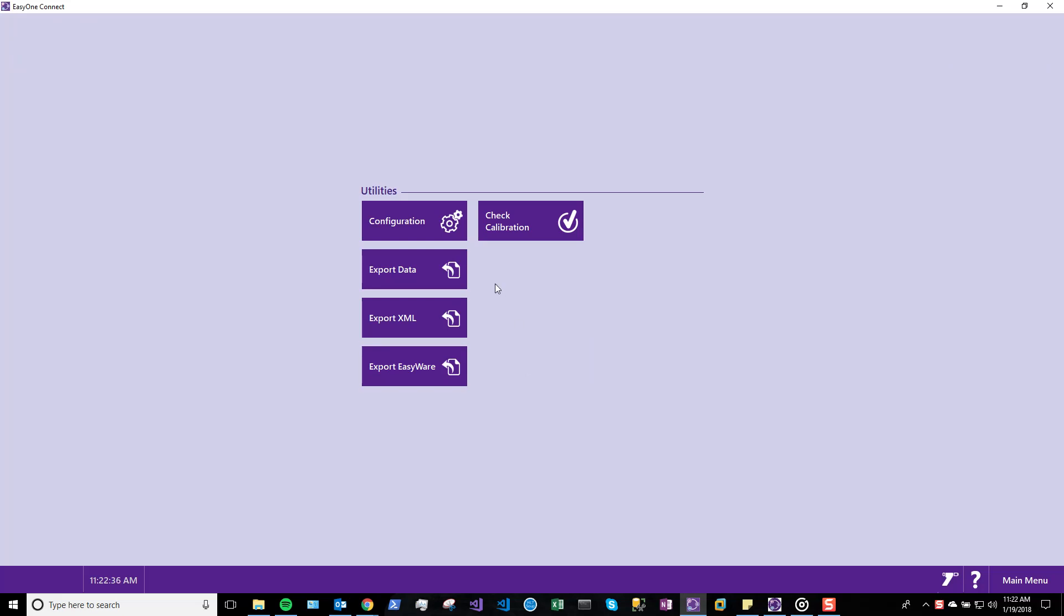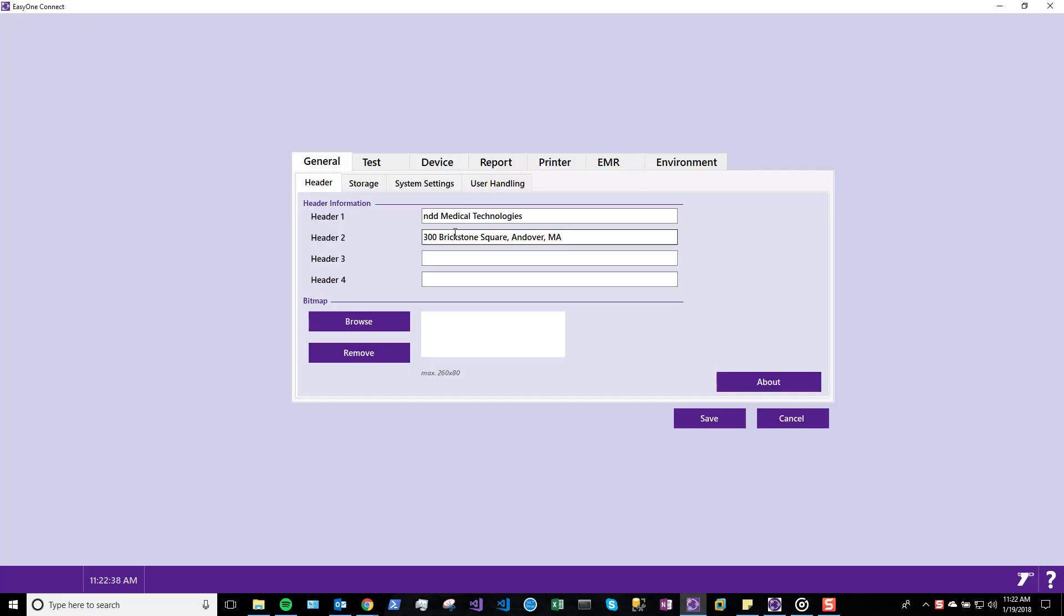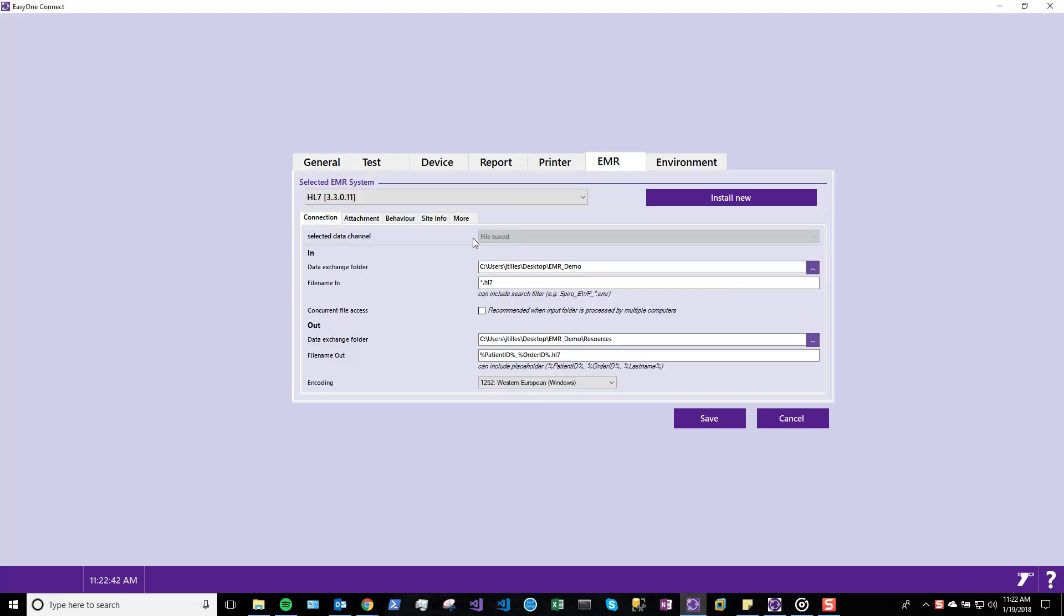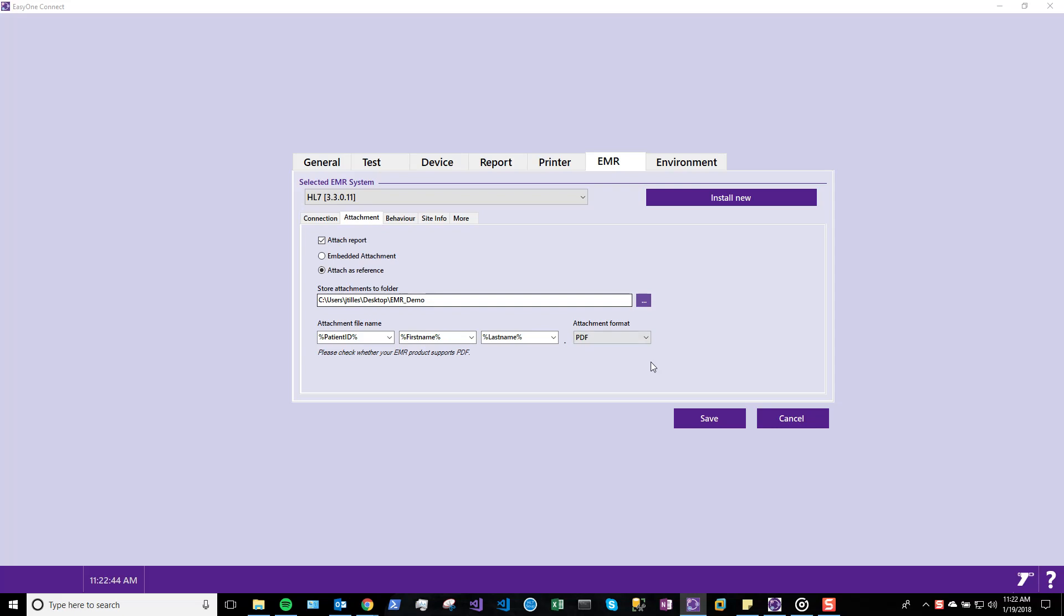Under Utilities, select Configuration. Now, go to the EMR tab to see the settings for your EMR connection.